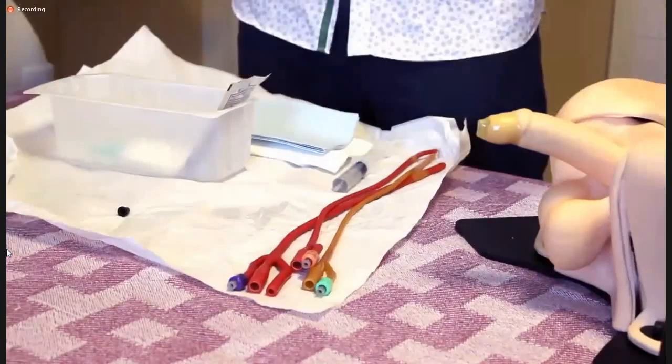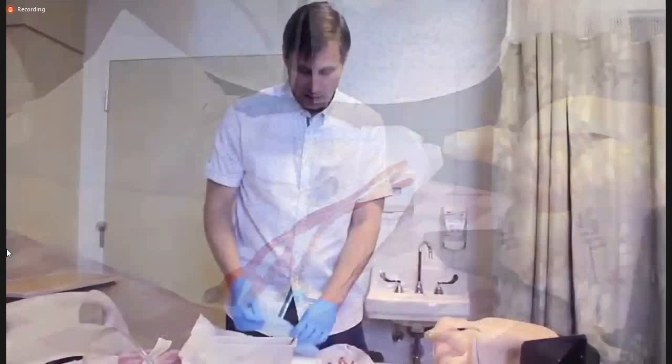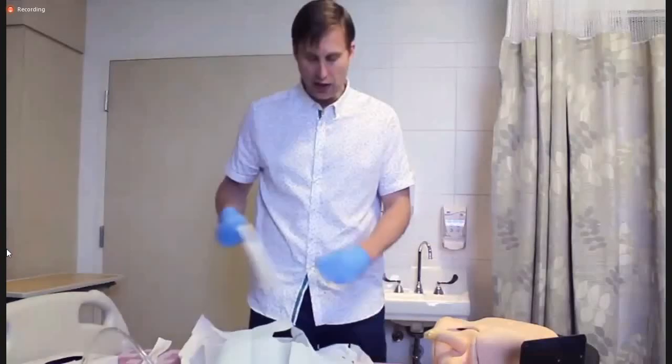Well, once you've determined that a patient needs a catheter, you'll need some equipment. So come on over here. In terms of catheterization equipment, you'll need a set of sterile gloves. In this case, it's not completely sterile. You'll also need a sterile drape set. Most catheterization kits will come with a sterile drape, usually in two parts.